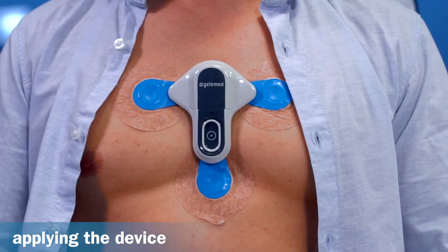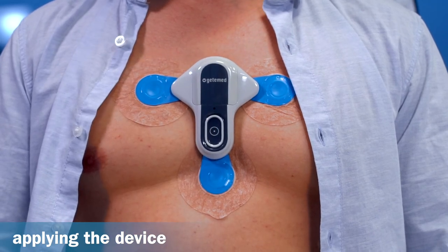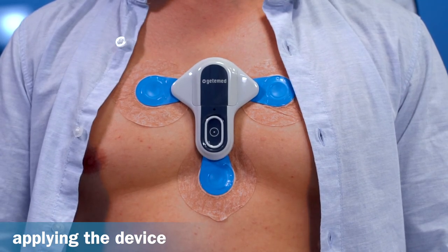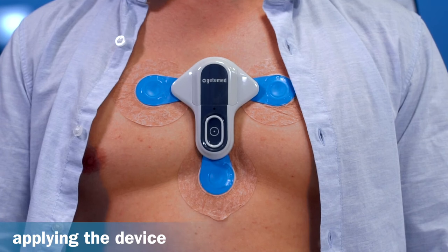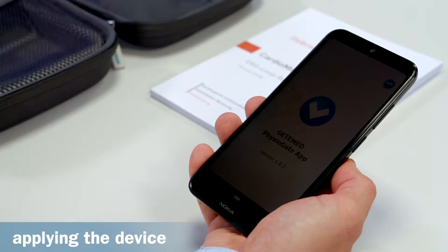To record an event manually, simply press the button. After releasing it, a short beep sounds, informing you that the event is being recorded. Once the recording is finished, it will be transferred to your smartphone and then transmitted to your doctor or service centre.